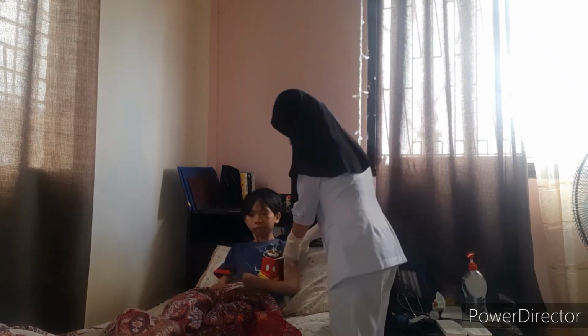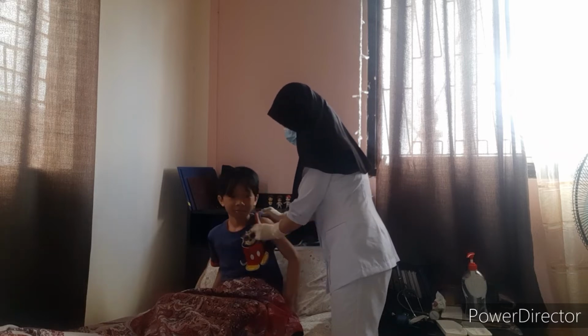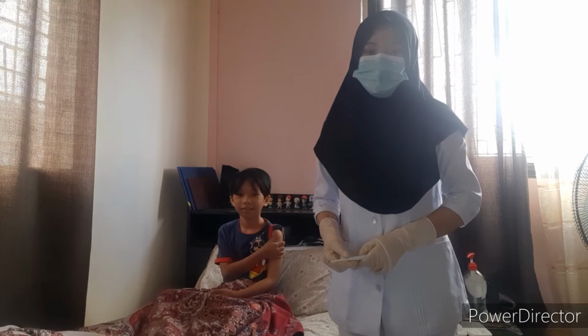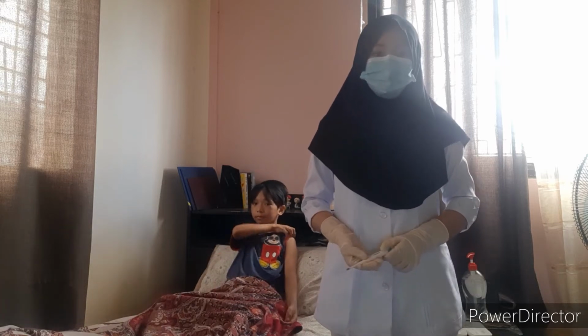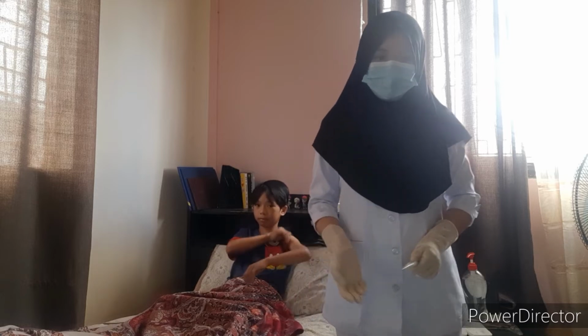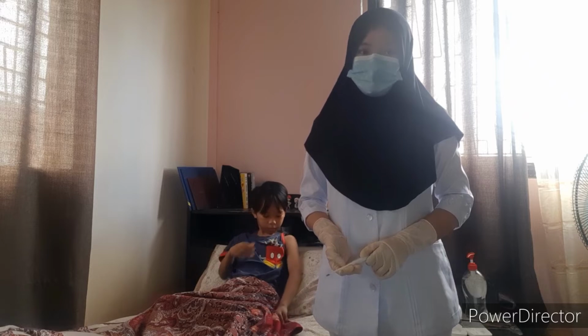So, sir. Okay, so make sure the axillary skin is dry. If necessary, pat dry. So this is to remove the moisture and prevent a false low reading.